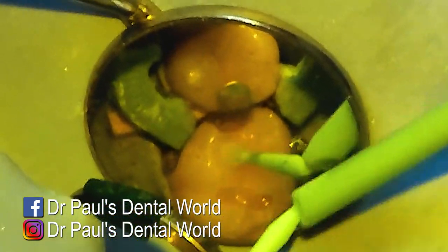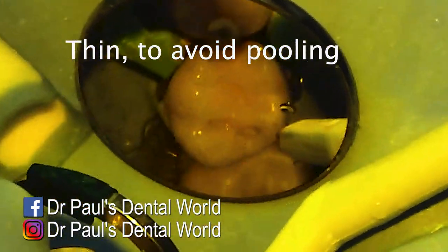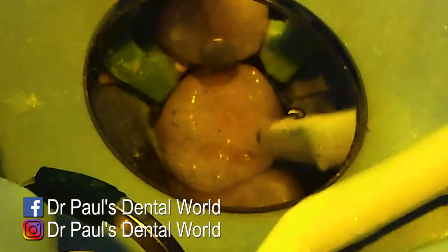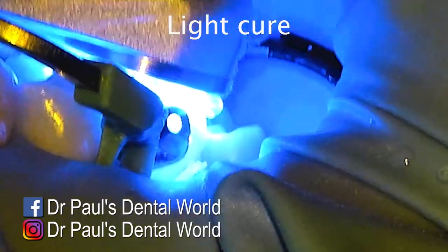When you thin the bond, you don't want it to pool at the base — you need to make sure that you do thin it enough, almost to the point where it disappears. Then you're going to cure it, and after you cure it, it comes to actually placing the resin.